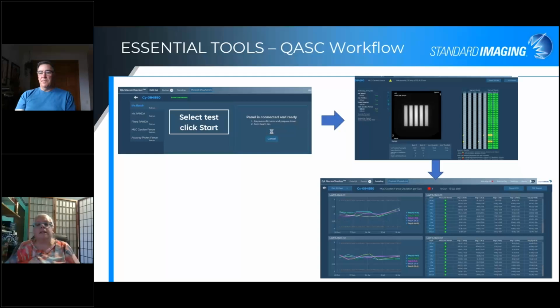And then there's another question here. Any device with software for focal spot test of a kV X-ray tube on the Linac? That we don't. Just a kV imager QA? Yeah, that's more specific to diagnostic test, and we don't really do any of the focal spot testing on that.